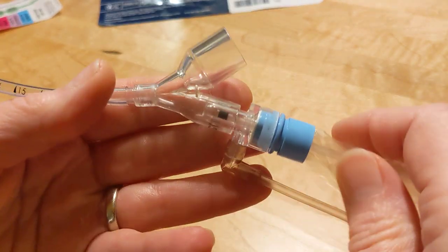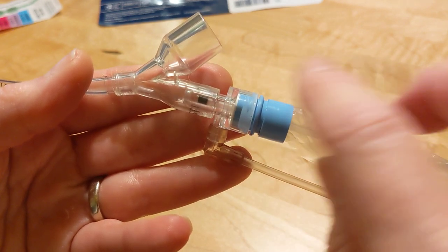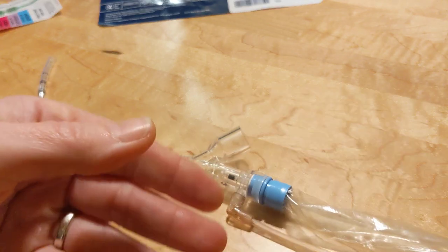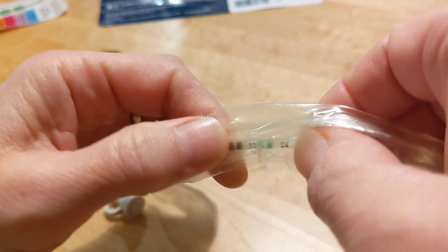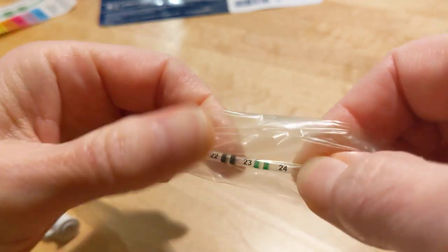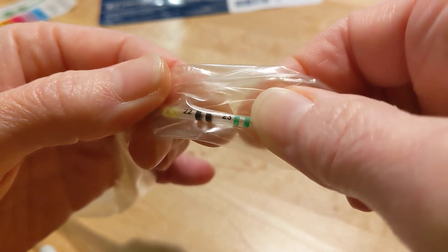So that's where we're going to go to — we're going to go to the 23 in this observation port or window. The 23 on the suction catheter is actually between the double black and the double green.